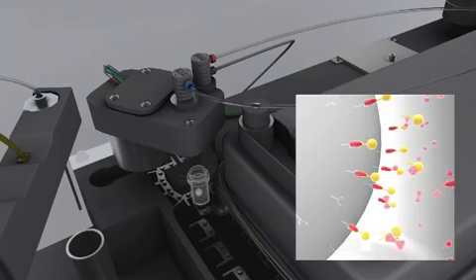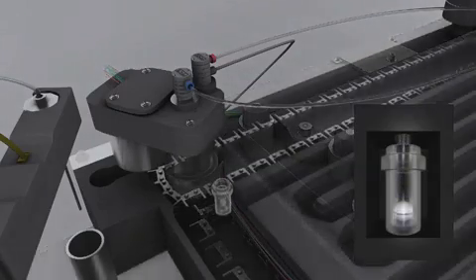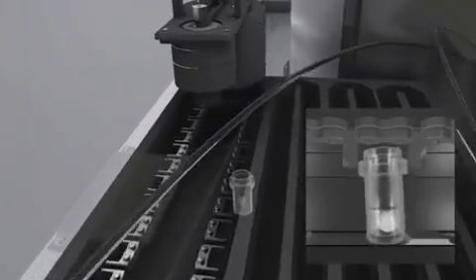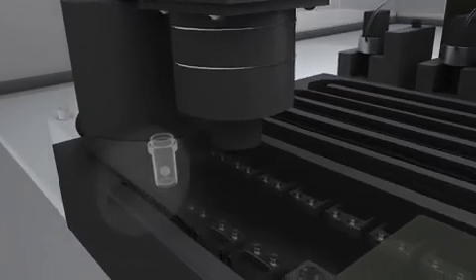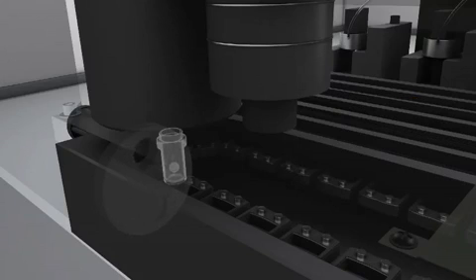The tube is then moved under the substrate probe, and 200 microliters of chemiluminescent substrate is dispensed onto the bead. The substrate reacts to an alkaline phosphatase label that has become attached to the bead during its incubation period, producing light. After 5 minutes in the luminometer, the light reaction is read. The tube is pushed into the luminometer disc and rotated in front of the PMT. Readings are then taken and averaged.